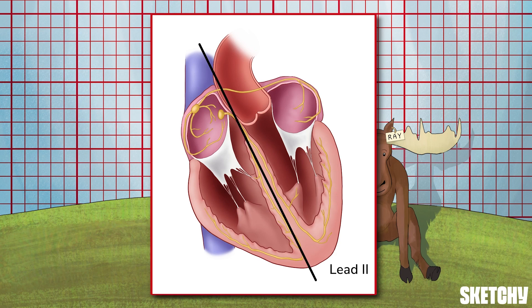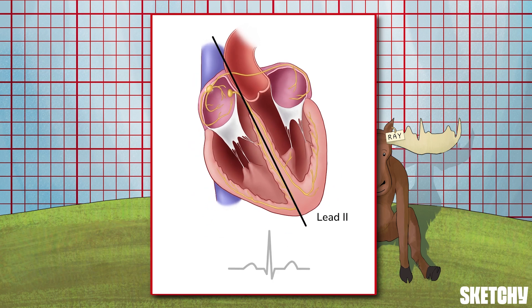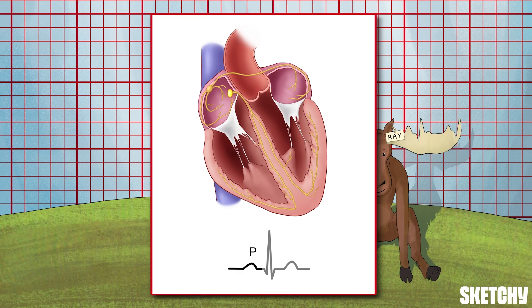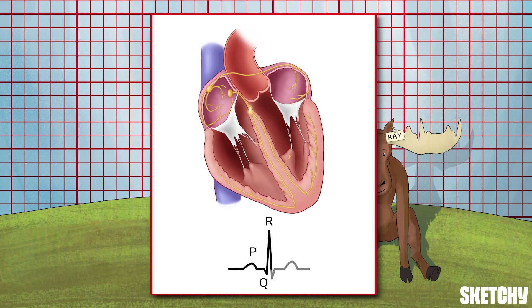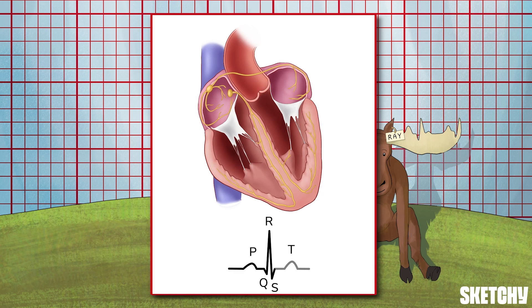Let's see what the Lead 2 tracing looks like during a single cycle of cardiac contraction and relaxation. Lead 2's point of view is from the apex. The P wave is formed when the SA node fires and depolarization moves through the atria. The impulse normally pauses momentarily in the AV node — hence the PR segment. A small Q wave represents septal depolarization, the R wave is ventricular depolarization, and the S wave occurs when depolarization finally reaches the furthest basal parts of the ventricles. The ST segment is the moment when the ventricles have fully depolarized and contracted but before repolarization begins. Finally, the T wave corresponds to ventricular repolarization.